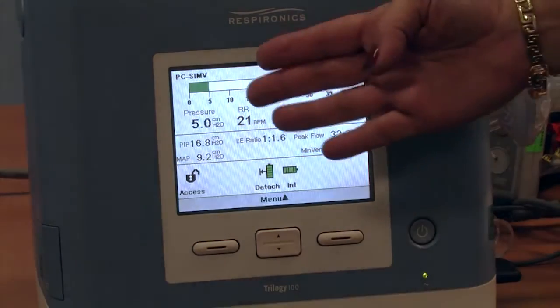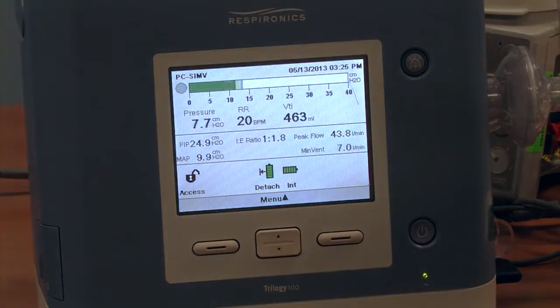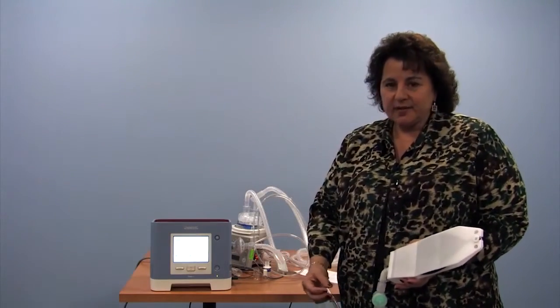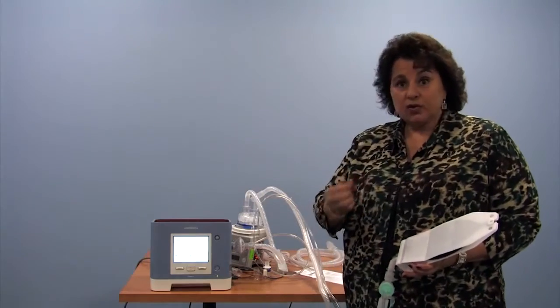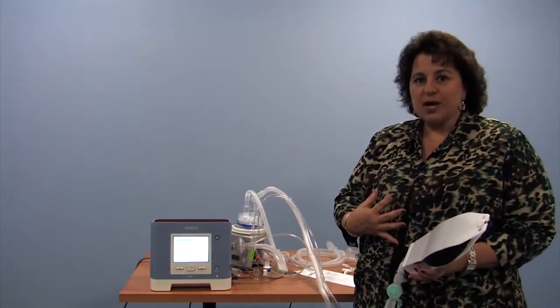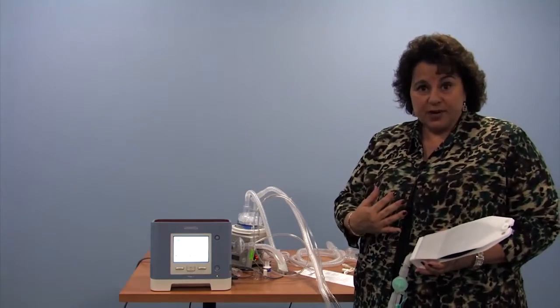Perhaps there was an extra dose of sedative or something that changed your child's drive to breathe. You might notice that there's less of the light triggering, possibly. So one more subject we need to tackle here is water in the ventilator circuit. We do, for patients with small tracheostomy tubes, do hope to keep the secretions moisturized and humidified so that there is less risk of plugging of the tracheostomy tube.